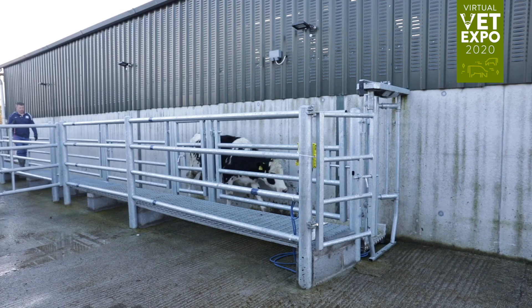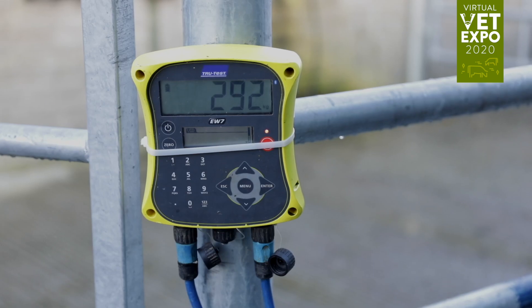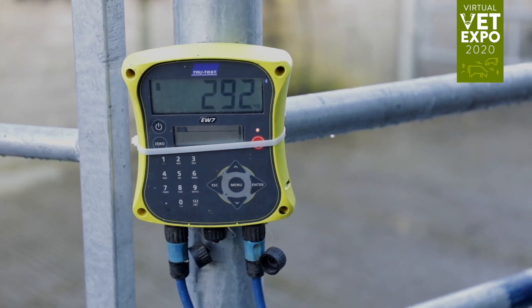Securely lock the animal in the crush. Accurately determine the weight of the animal, either through weighing scales or a weight band.